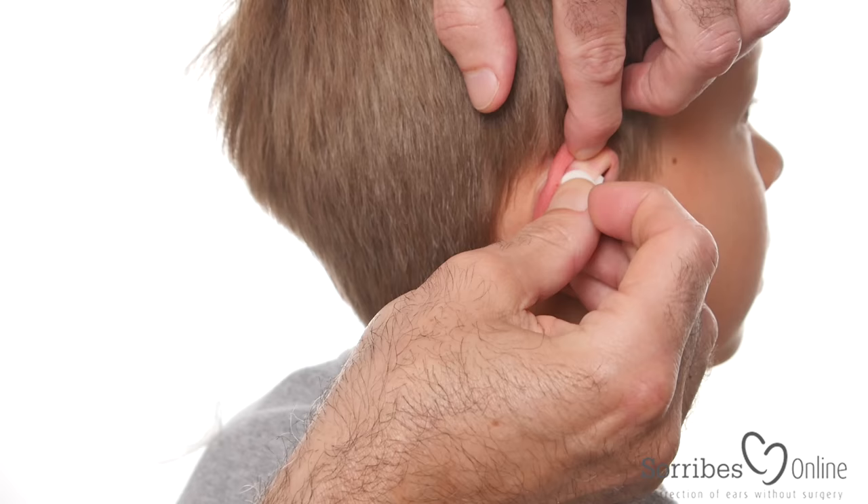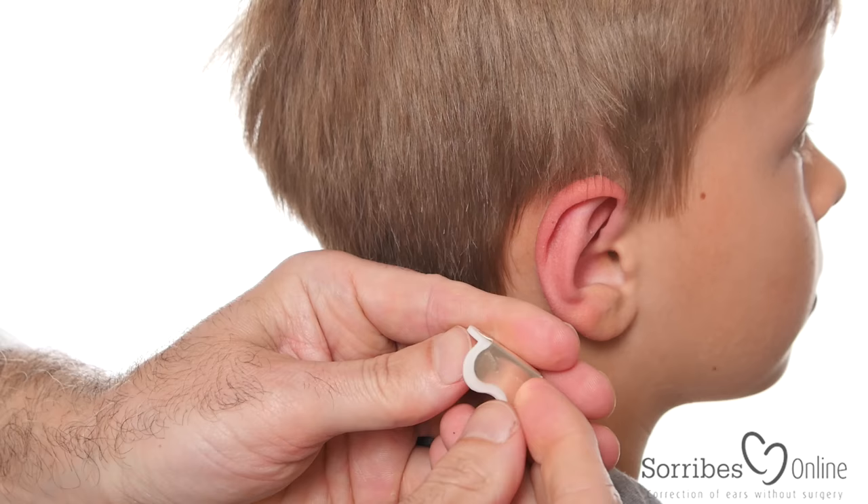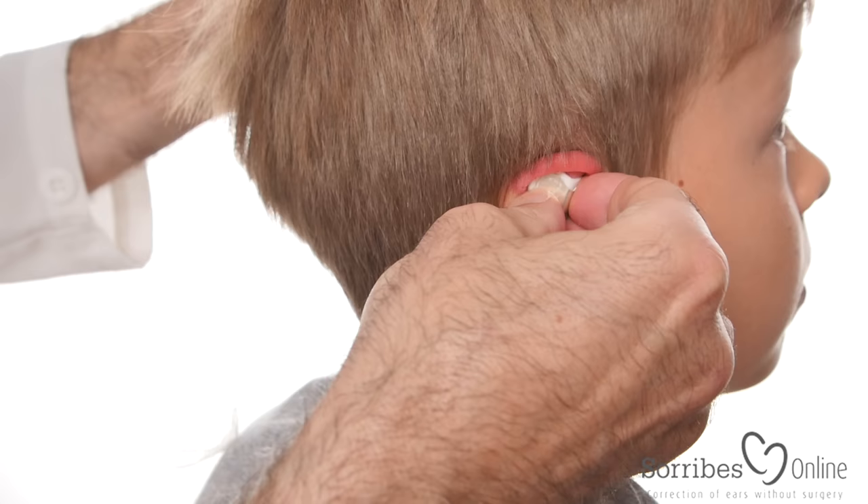When you take it off, you just take it from the top of the ear and peel it off gently, like that. And if you reattach it, you open it 90 degrees like this, and then you reattach it to the ear and squeeze it again.